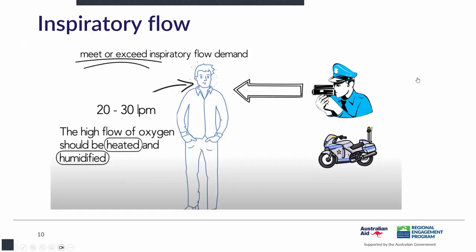All right. So now we get on to the juicy stuff. So we've decided that the patient in the last video probably does require some high flow. What the next 3 slides are going to try and describe is how high flow works. And sometimes this can take a while to process and understand. I know it took me a number of months of thinking and working with high flow to fully understand how it actually does work.